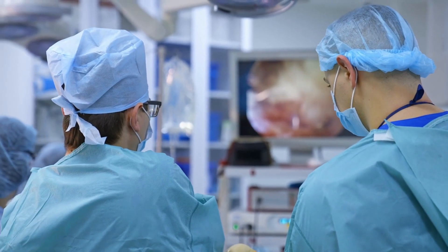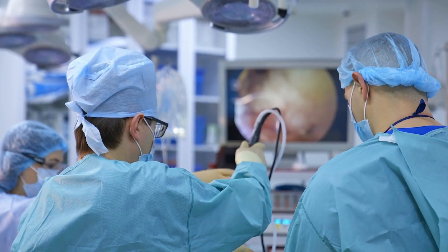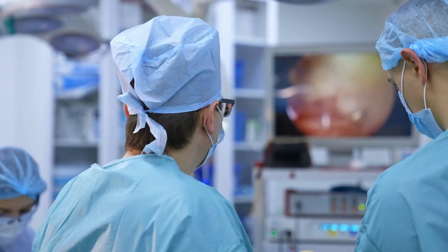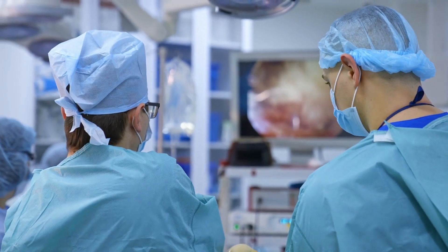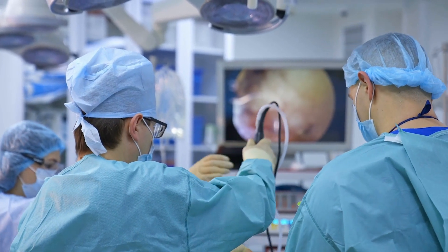The third important issue while cleaning any laparoscopic instrument is the presence of organic matter. Blood and other organic matter present inside the lumens and channels of a laparoscopic instrument can become trapped in the instrument channels, making it very difficult to remove.